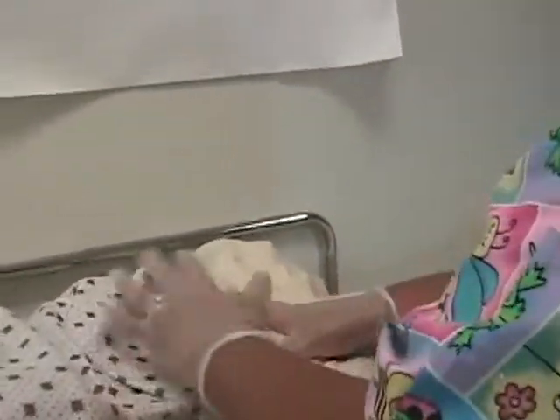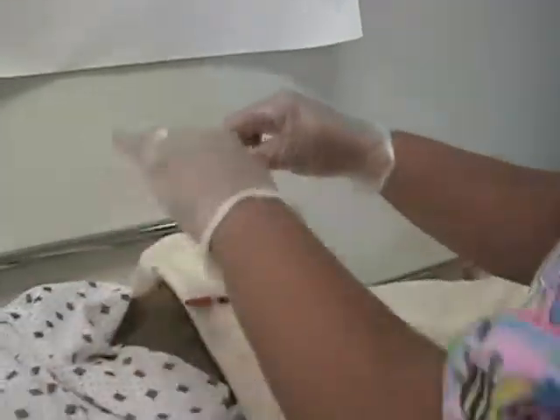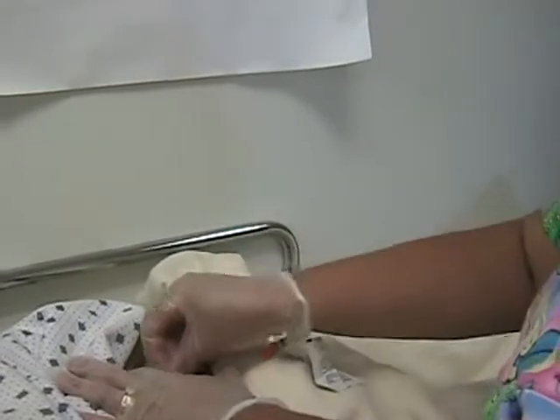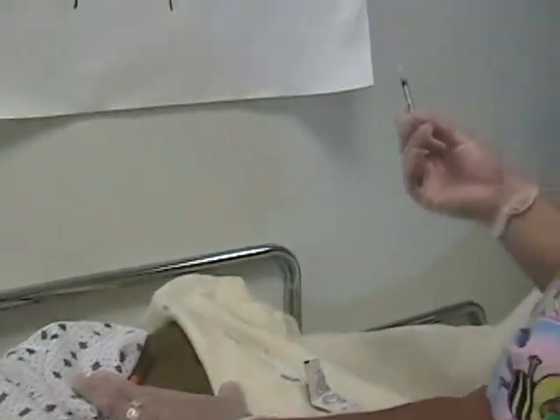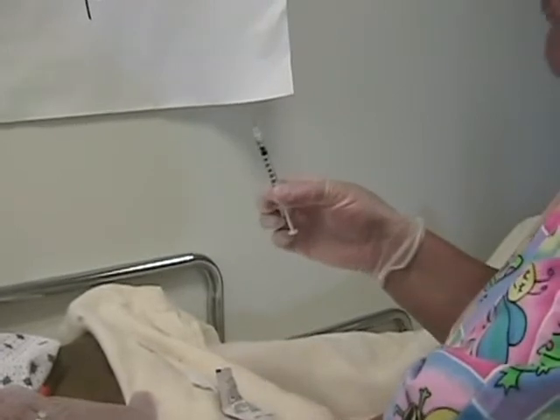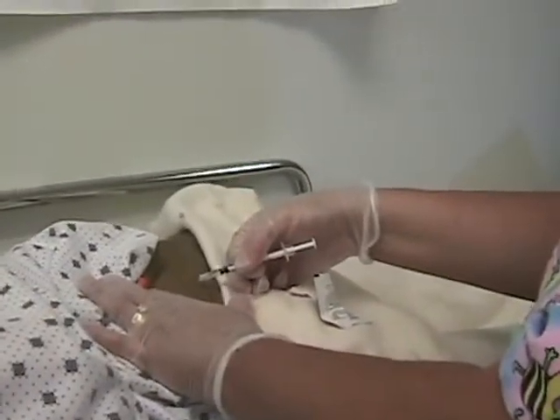The idea with exposing the skin is you want to be able to grab and make sure you have all your equipment available there. Go ahead and open your alcohol prep first. Pinch the skin. Wipe with a clean sweep. Go ahead and let it dry. Undo your insulin syringe. Subcutaneous injections go 45 degrees or 90, and bevel up. Please remember bevel up. I'm going to go ahead and do it at a 45-degree angle.